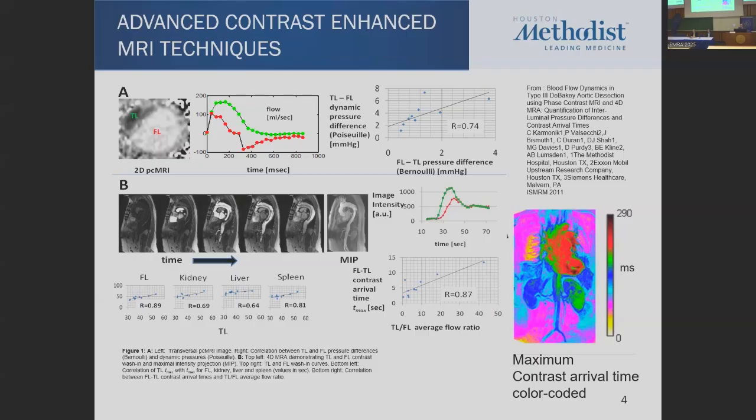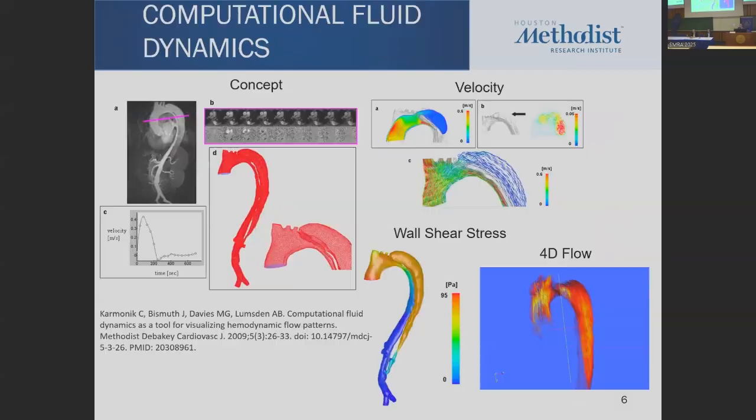So essentially, and this was really what I learned in interaction with a vascular surgeon, what is needed, what's important is to use these technologies to have some statement about the patient, or patient-specific results. Then you can take this a little bit further. And at the time, this was computational fluid dynamics, shown here in one case of a chronic aortic dissection. So here we don't have a moving septum.